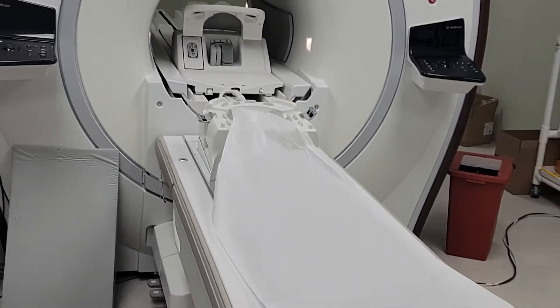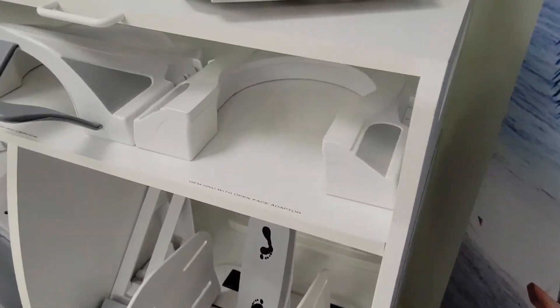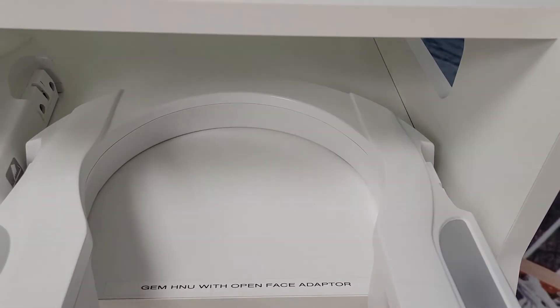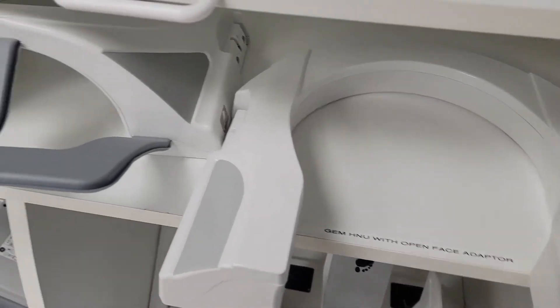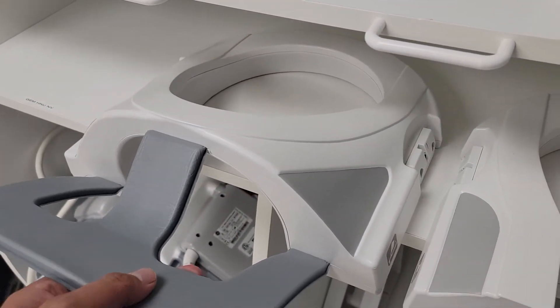Head, neck and spine coil right there guys. There are other pieces to that. For this one, you'd slap this one on here. You can do a T-spine, C-spine. But this is really the one you should use for the C-spines — this one right here.